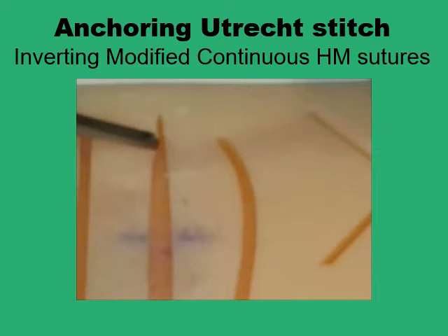The Utrecht stitch is quite similar to the Cushing and to the Connell in that they are basically modified horizontal mattress sutures, modified to invert the wound edges, and they are continuous units of horizontal mattress sutures.